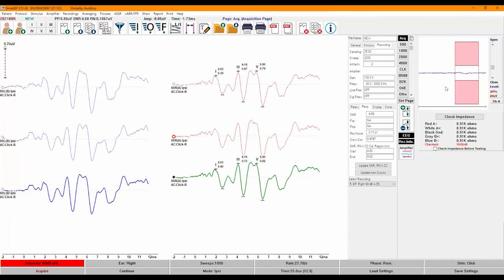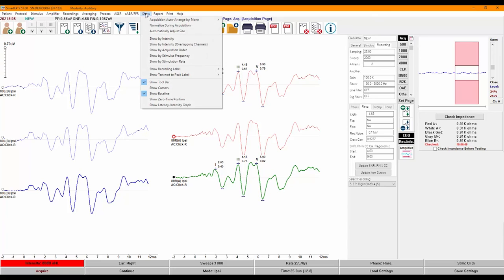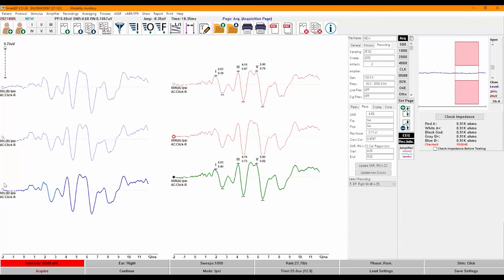In the recording panel, you will see in the comments that this recording is a sum of two recordings, and the number of sweeps totals the number of sweeps in the first plus the second. You can also activate stimulus information for your recordings from the Show menu, by going to Show Recording Label and clicking on Stimulus Information. Some sites prefer to have the extra information, while others do not need it.